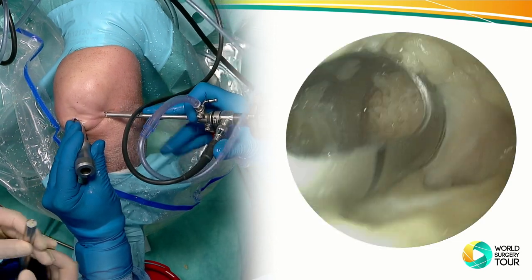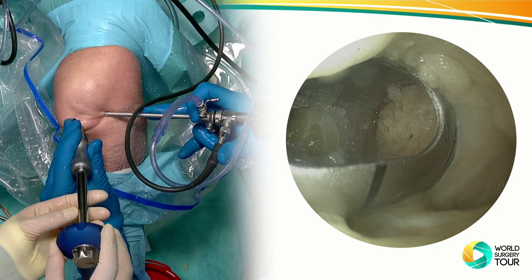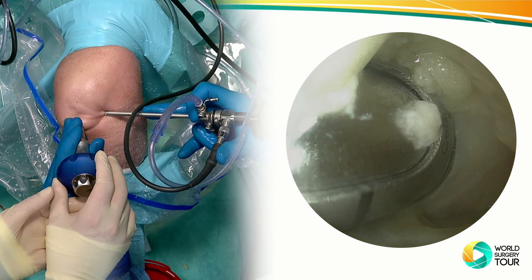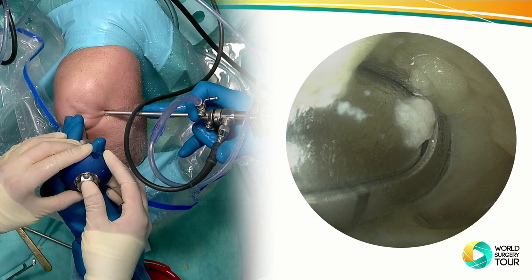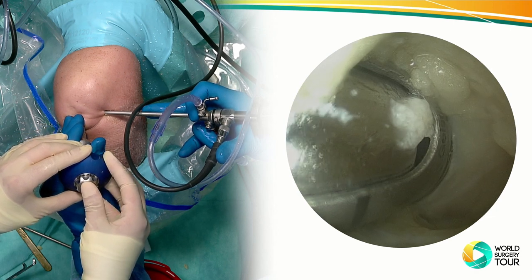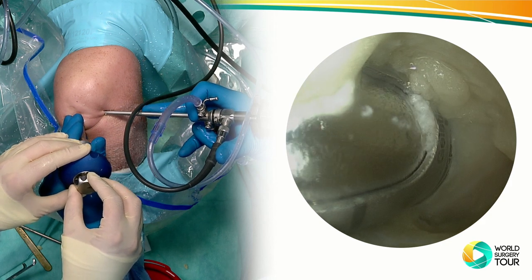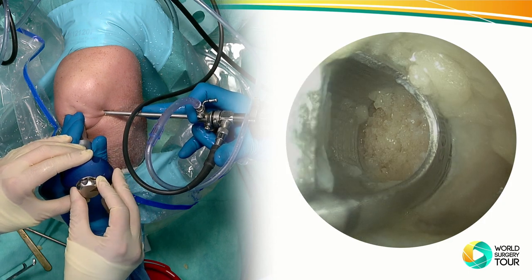And now we can apply the construct. Move it in. Okay. Slowly. And with a gentle push. It clicks. There we go. No, not yet. Push it in. No, still gluing.